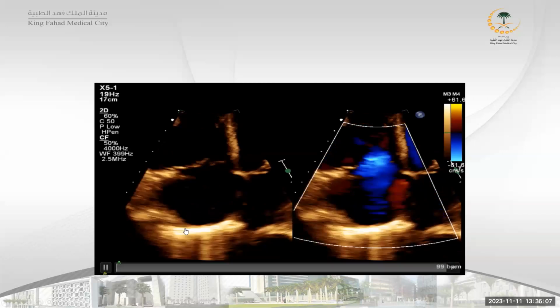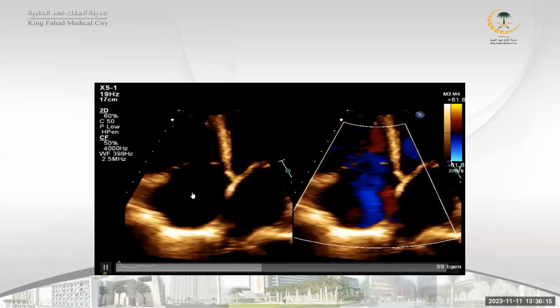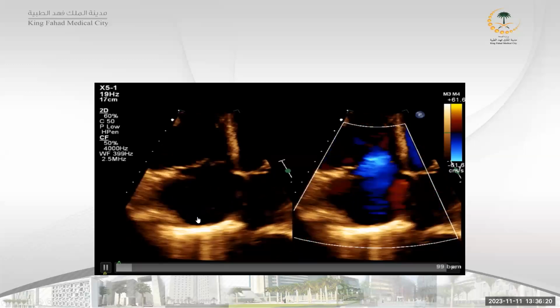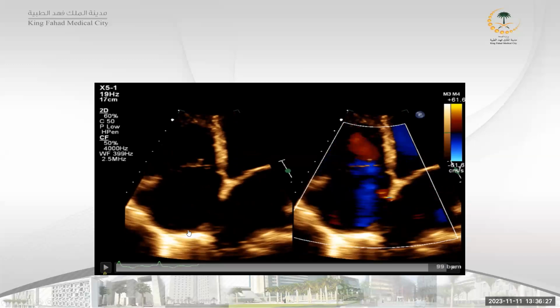The crista terminalis, in this view, will appear as just a fixed thickening, usually at the roof here. It will not usually extend, and if it does extend, it is usually a fixed linear structure. But this is uncommon. Commonly, you'll have just a rounded thickening here, and this is the crista terminalis. But if it is very prominent, it can extend to the septum as just a linear fixed structure, not filamental like this, not hypermobile.